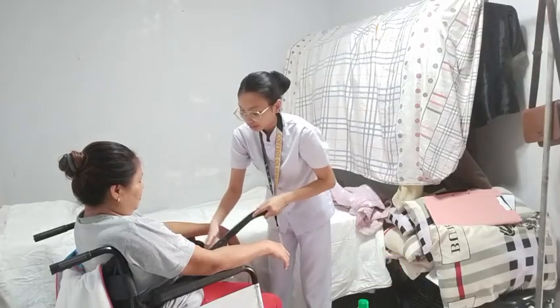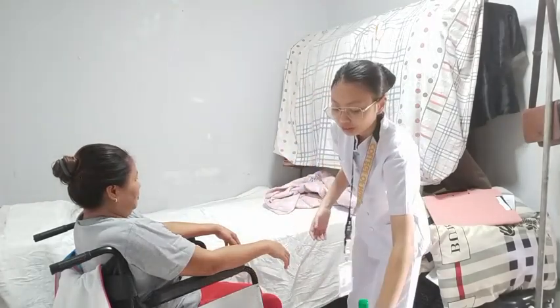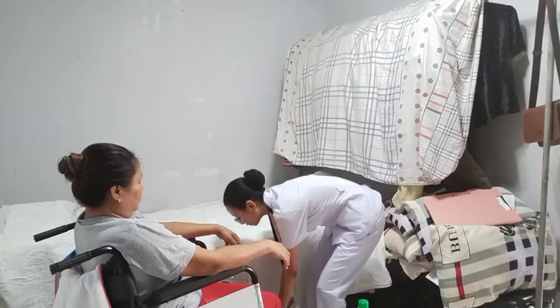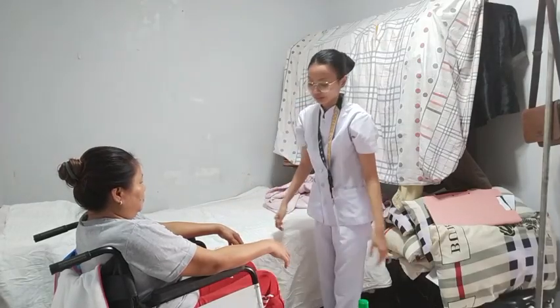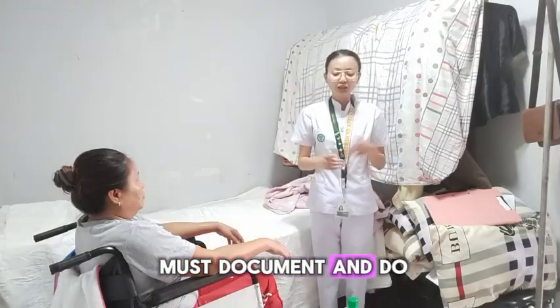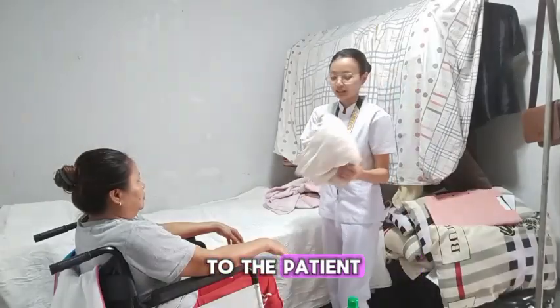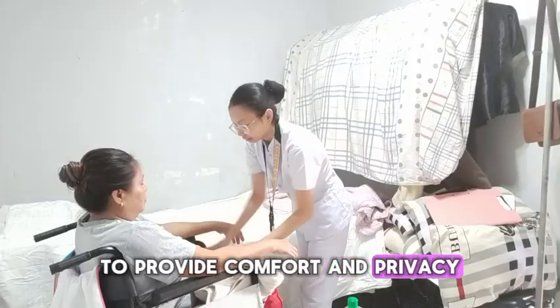After that, I will now remove the belt. After removing the gait belt, you must use the footrest. And after that, we must document and do the hand hygiene. But before that, we must also provide a towel or comforter to the patient's lap to provide comfort and privacy.